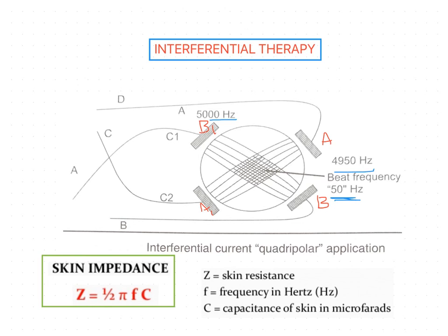Why? Because of a physics rule that skin resistance Z is equal to 1 by 2 pi F C, where Z is the skin resistance, F is the frequency in hertz, and C is the capacitance of the skin in microfarads. Here we are applying over the skin, so the capacitance of the skin will not change.